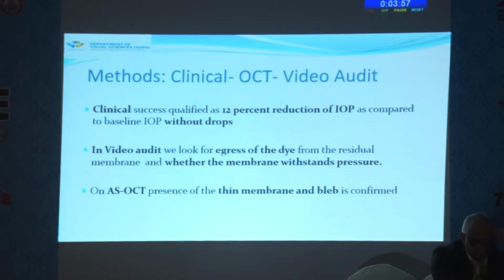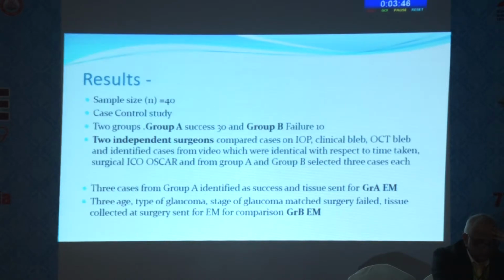On clinical, we qualified success as a 12% reduction of IOP without drops. In video audit, we look for the egress of the dye from the thin membrane, and on OCT we look for a thin membrane with a continuous bleb.